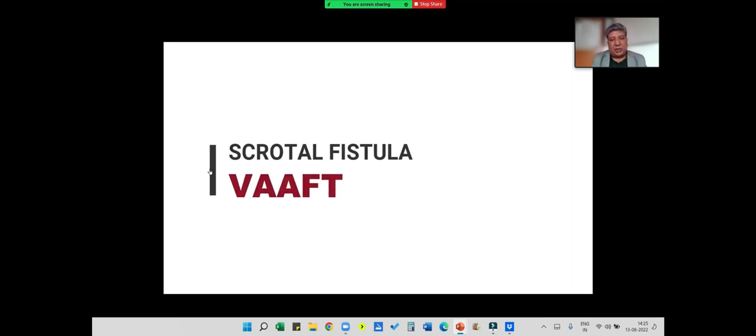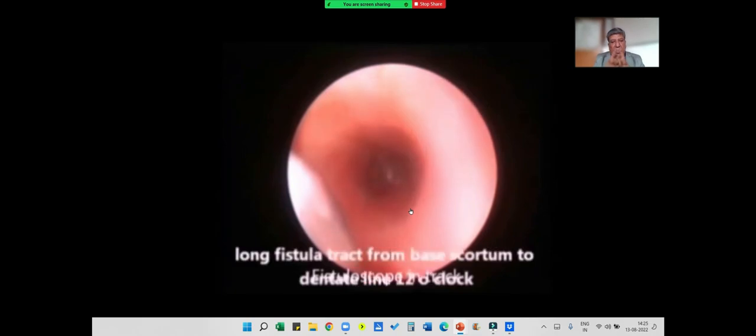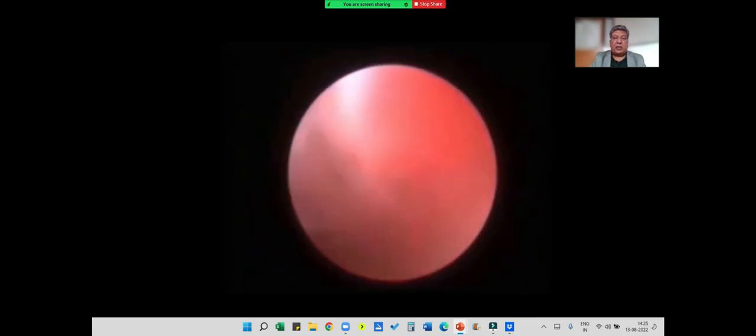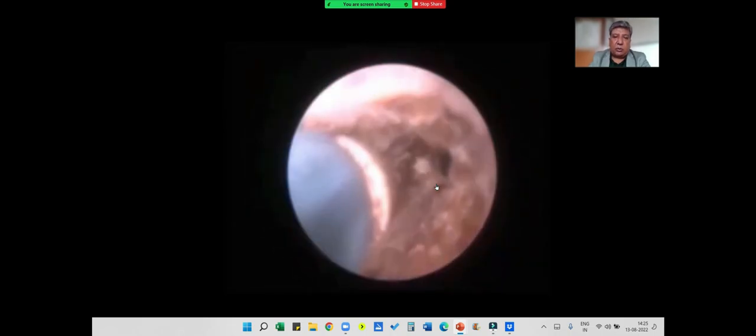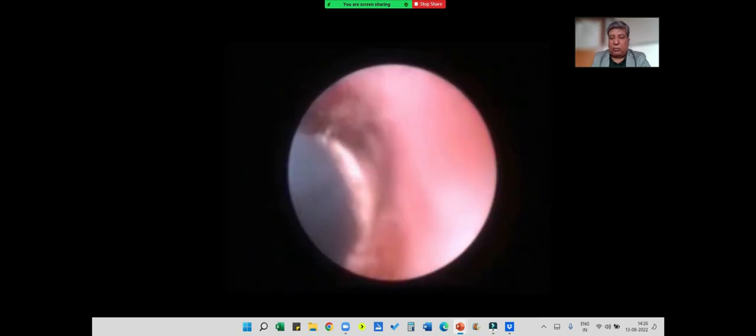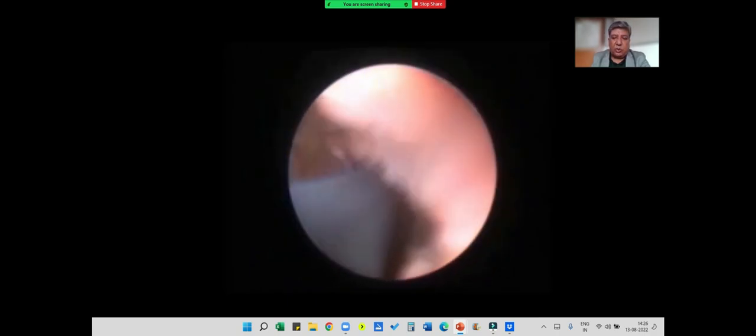Now just to show you how the results can be, the patient had a scrotal fistula. It was a very long tract, starting at the base of the scrotum and going all the way down. So what we did was we put the scope inside and we put the light. The light comes at the internal opening, so you know this is where it is. Inside the tract, you see a straight tract going down, and you will see a lot of slough inside it. So you need to take the slough out, clean it out, brush it out, and after that you cauterize it. And again, you need to brush, and after brushing it, the external opening is enlarged slightly, and you keep washing this patient every 2-3 days when the patient comes to you, and you will see within 14 to 21 days the patient has completely healed.